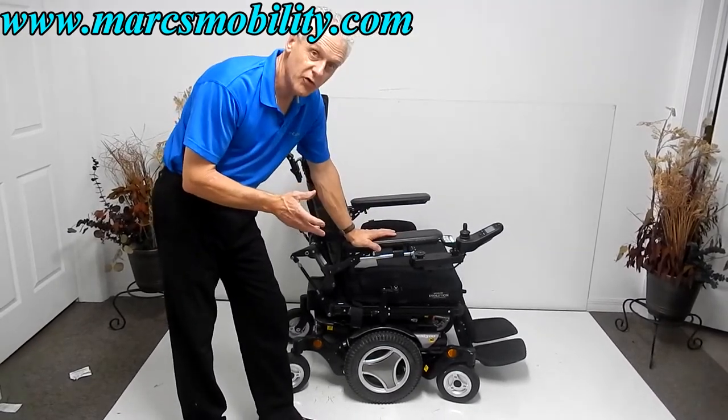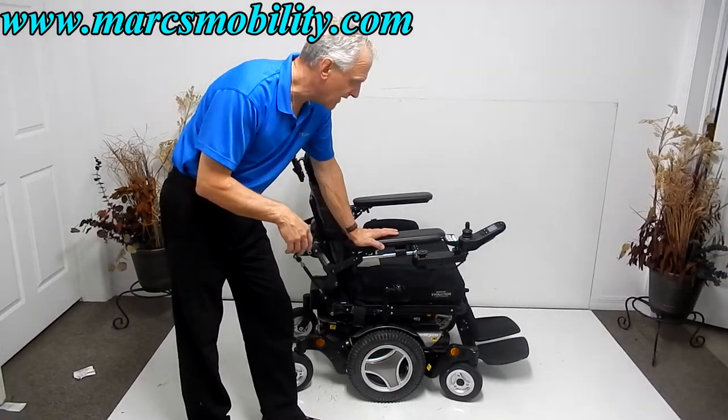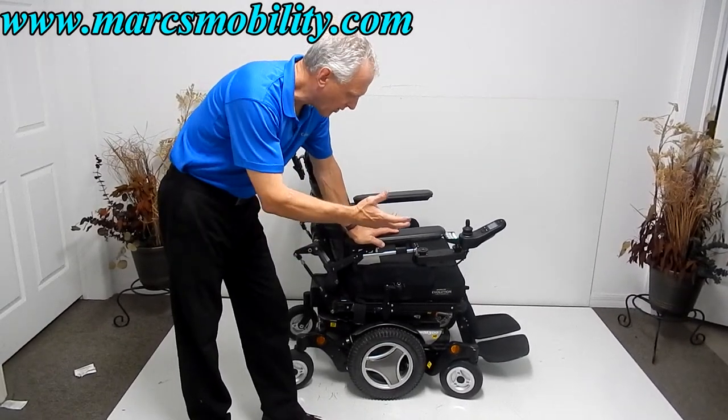This power chair is almost new — it has only 13 miles, which is a month or less of use. The tires are all brand new.